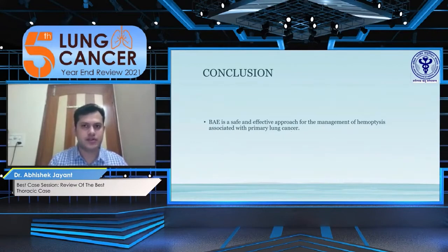It increases the overall quality of life of the patient. And in cases when the patient is planned for surgery, like in our case, it would lead to a decrease in the overall vascularity of the tumor, which would in turn lead to a better surgical outcome.